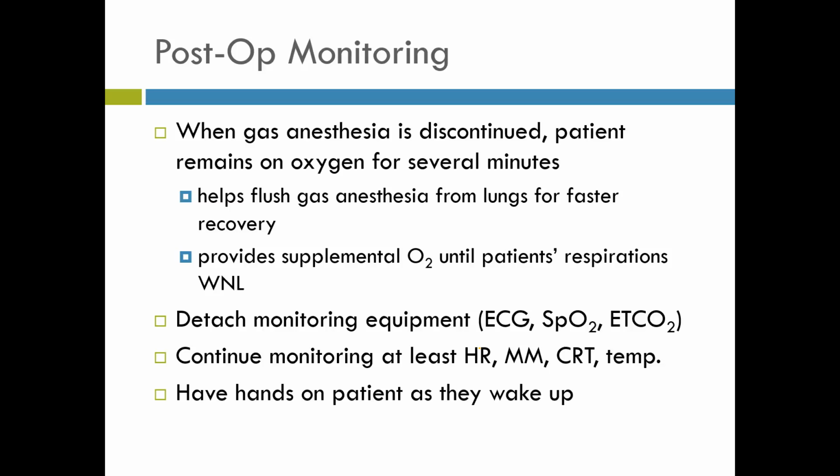At this time, we're going to detach monitoring equipment, so our ECG, SpO2, and our end-tidal CO2. We're going to continue monitoring at least the heart rate, mucous membranes, capillary refill time, and temp manually at this point. And we're always going to have a hand on the patient as they wake up, because recovering our patient after anesthesia is some of the most dangerous processes.